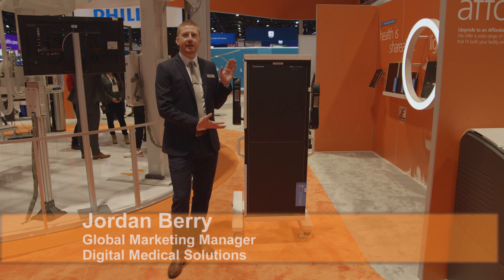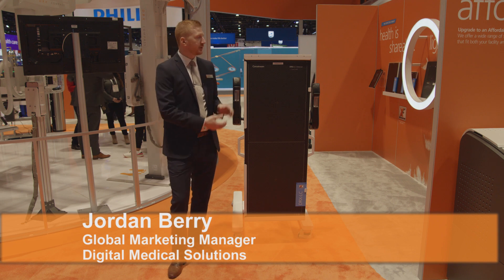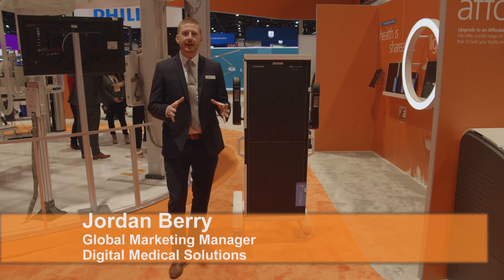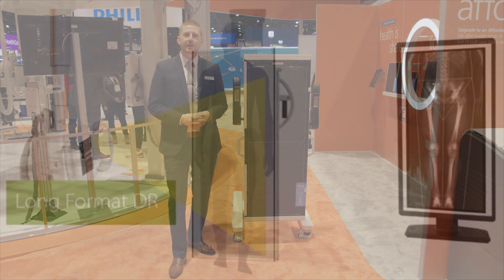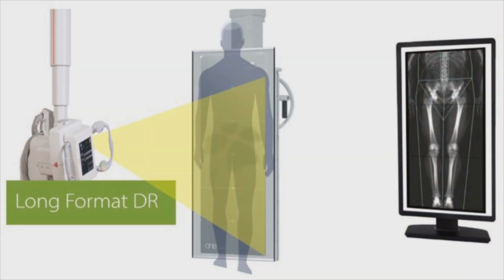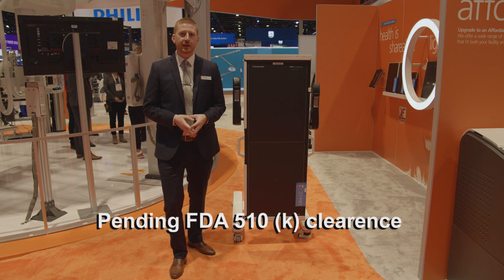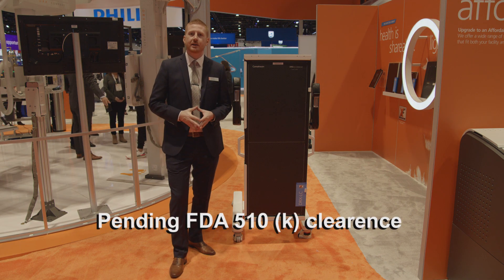The DRX-LC is our large format detector. With a field of view of 17 by 48 inches, it can easily accommodate long length images of the legs and spine. The DRX-LC acquires images in a single exposure, which drastically reduces hold time for your patients and minimizes their discomfort. The scan can be completed in less than one second, as compared to 15 seconds or more with a multi-shot DR solution.